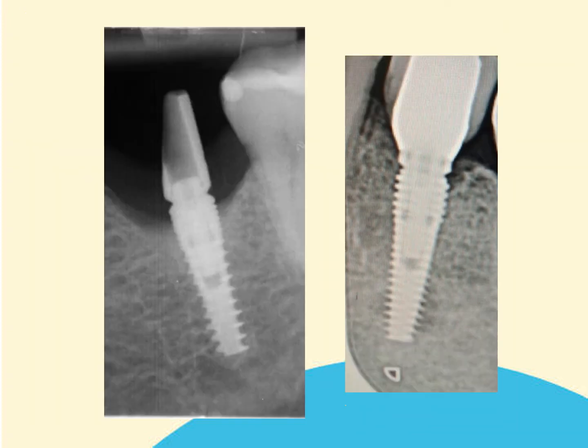So, to sum up this presentation, we're going to try and look at the radiographic features between an EasyPlant Series 2 type of connection and an anchor lock type of connection. First of all, radiographically, the implants can look very similar. They're both tapered in appearance. However, on the Easy type of design, the threads are much further apart than on the anchor lock design. The thread pitch is completely different. So that's one giveaway by just looking at the implants and the thread pitch.